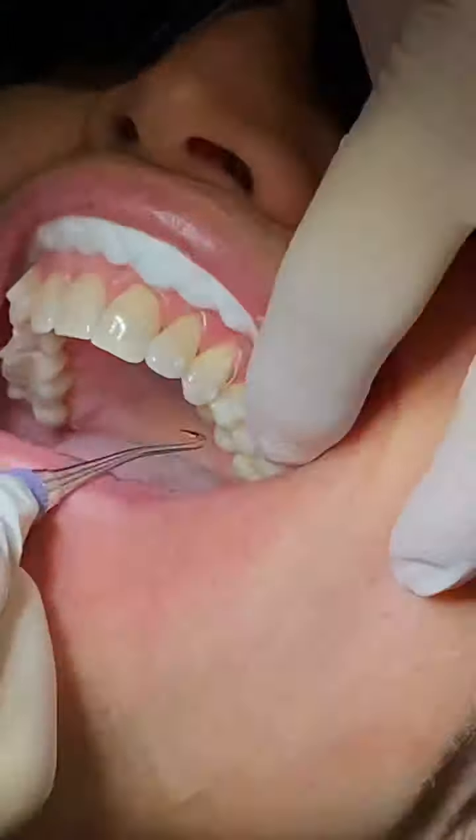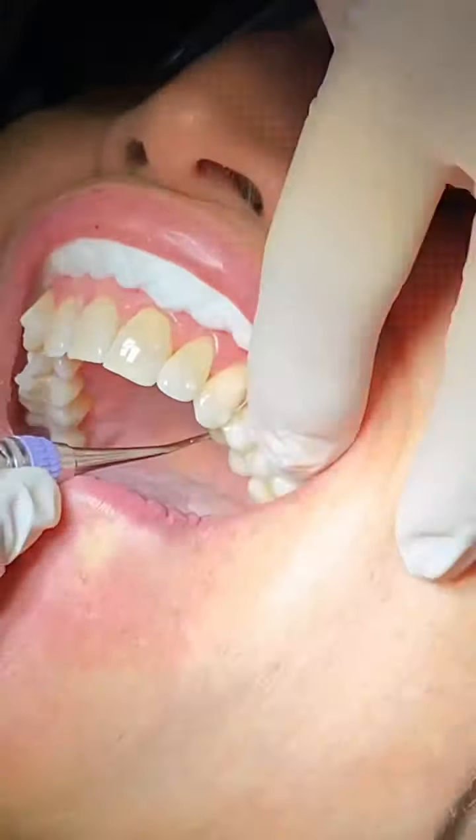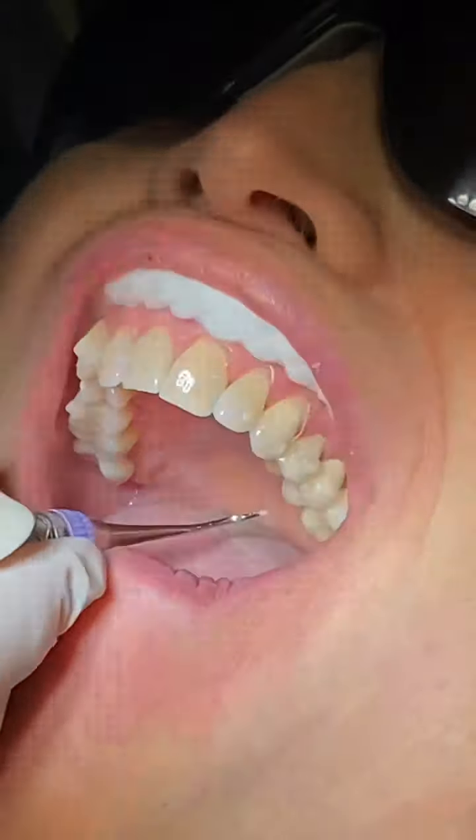The floss didn't go through, and we'll find a little bit of excess there. We floss again and it'll be fine.